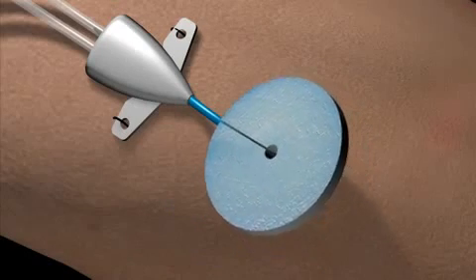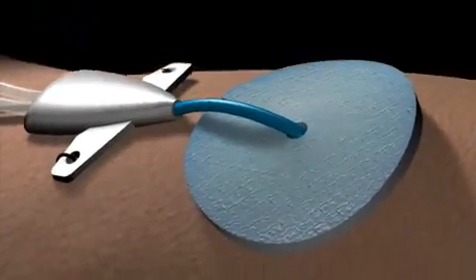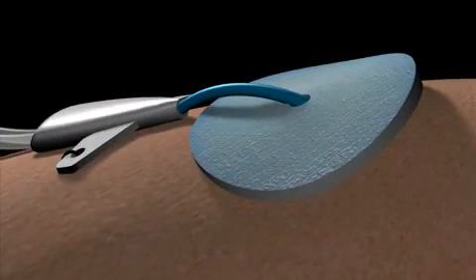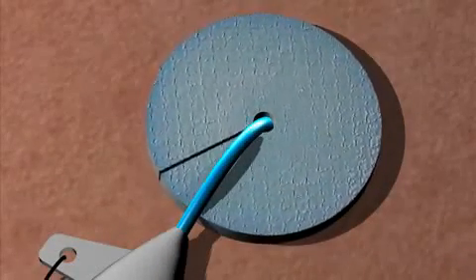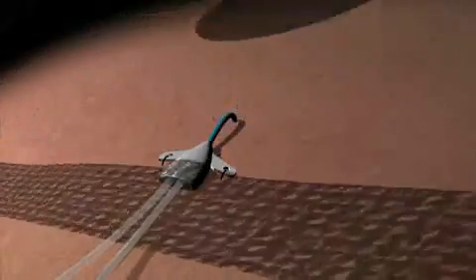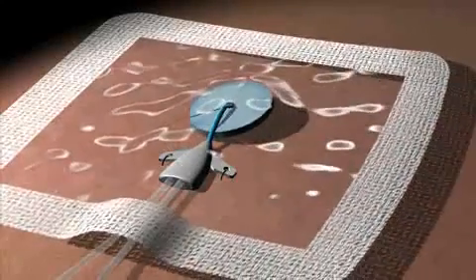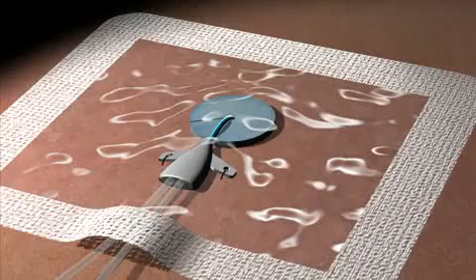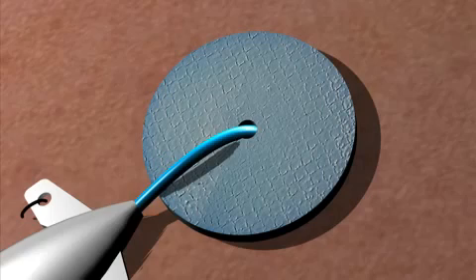Place BIOPATCH around the catheter or pin site with the CHG impregnated white foam side in direct contact with the patient's skin. Make sure that BIOPATCH is not laying on top of the catheter hub. When aligned properly, the pre-cut slit allows for an easy release of the catheter when the transparent film dressing and BIOPATCH are removed. If the slit is not properly aligned, the catheter can become trapped between BIOPATCH and the transparent film. Make sure the edges of the slit are touching. The BIOPATCH protective disc needs 360 degrees of contact around the catheter for maximum efficacy.